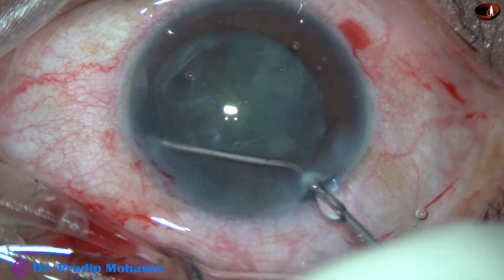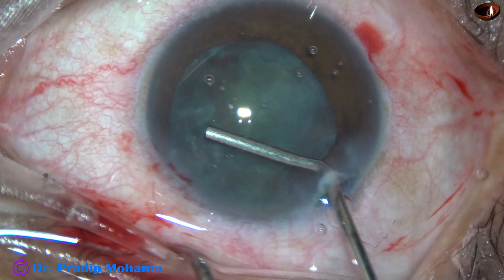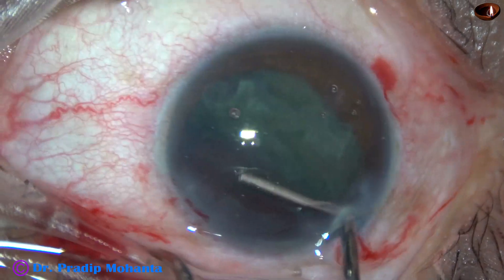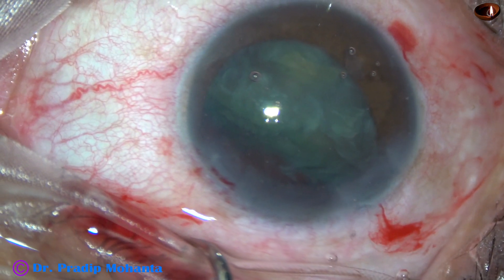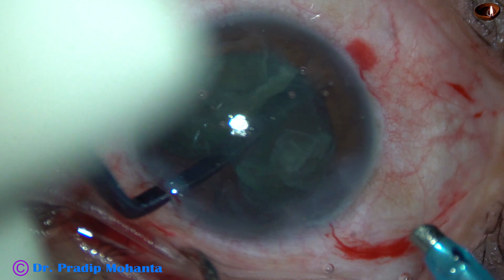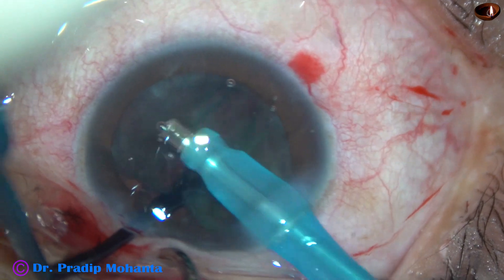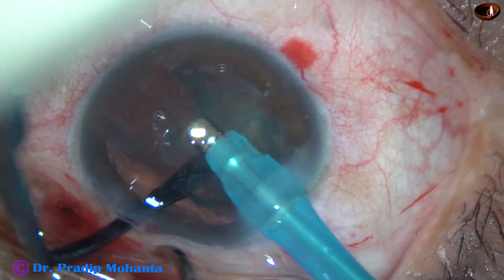Then I did hydrodissection and injected viscoelastic through this. The nucleus got pushed to the right side and inferiorly. I then took the posterior capsule protector, went behind it, and emulsified this portion of the lens mass, and then the other portion.